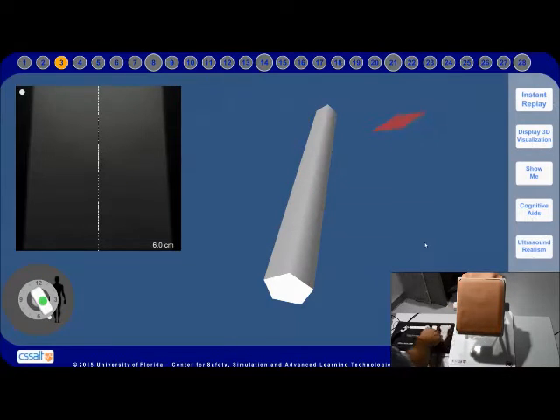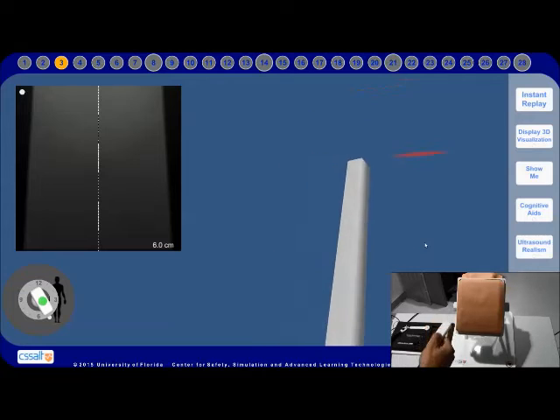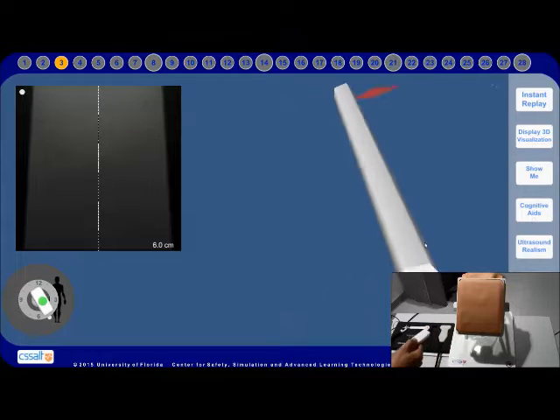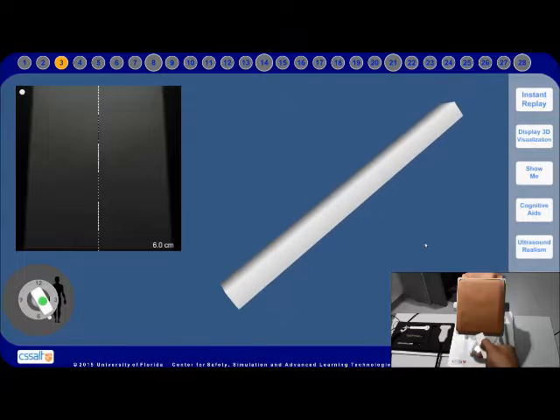The objects used in the ultrasound simulator are simple, recognizable shapes. We purposely left out anatomy so that learners can focus on cross-sectional literacy of familiar objects without having the additional burden of learning anatomy.